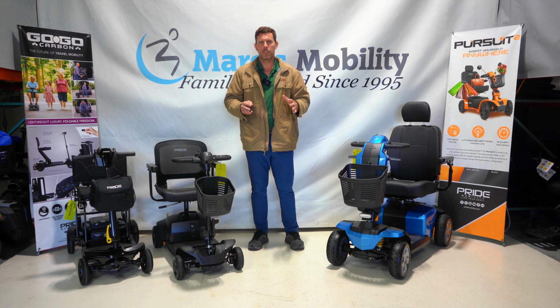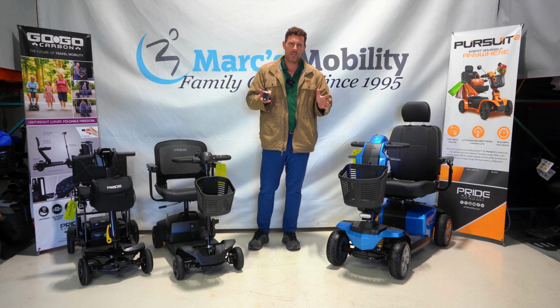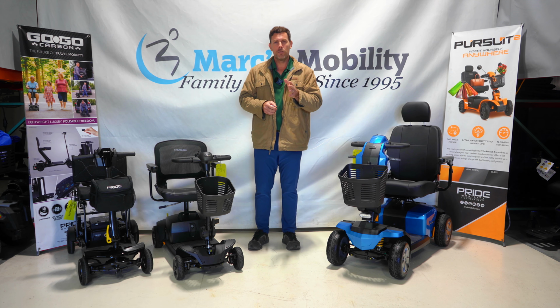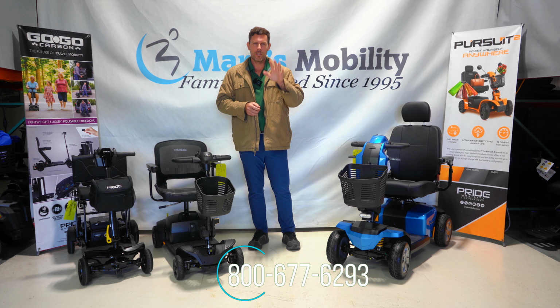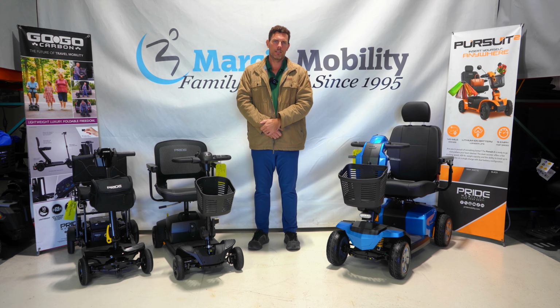Now, I do want to emphasize as well, this video is going to be a guide if you're looking to just try to narrow down what's going to fit best for your needs. But if you do give us a call, we do have mobility specialists that are going to go through these similar questions with you to really help identify the best product for your needs.